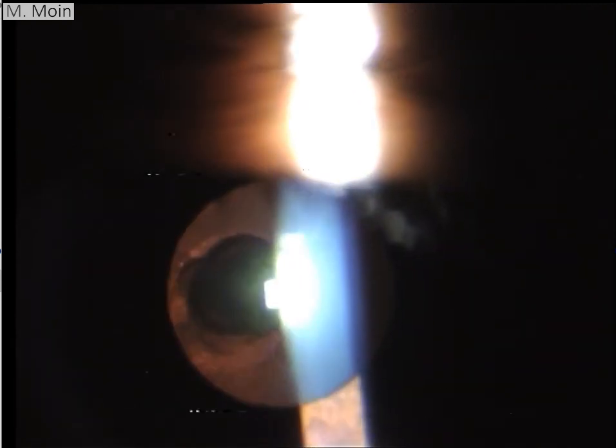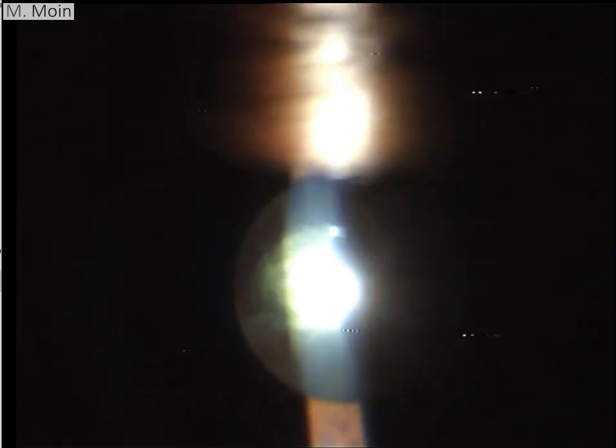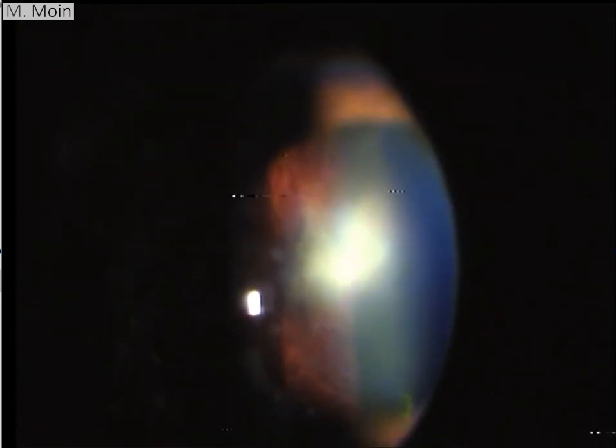So if you are going for a single piece IOL it's probably better off to have a multi-piece IOL in hand as well. So if you get a posterior capsular rent you can solve that and have a vitrectomy machine ready therefore doing these kinds of surgeries. Thank you very much for watching.